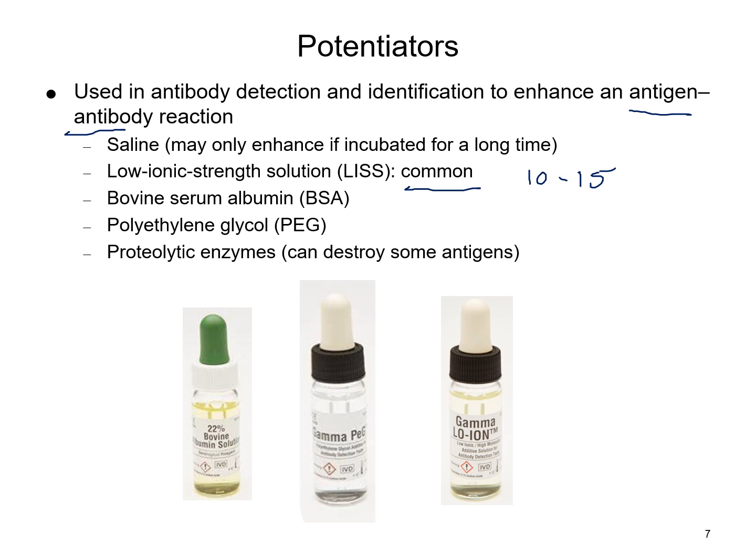You can also use albumin. So here's a picture here of your albumin.